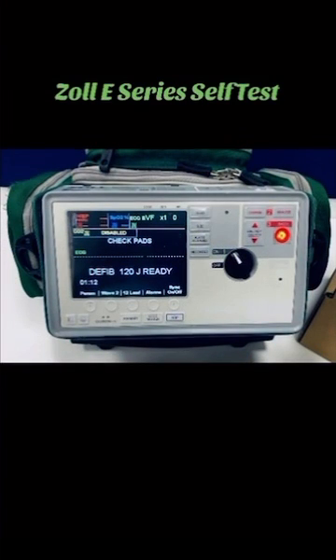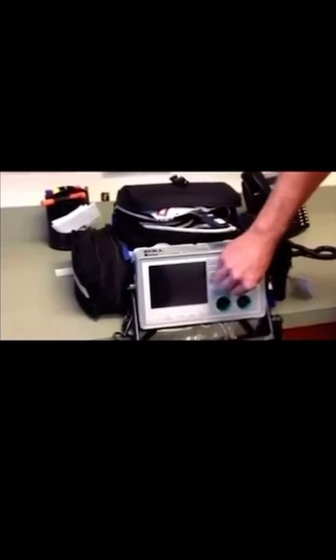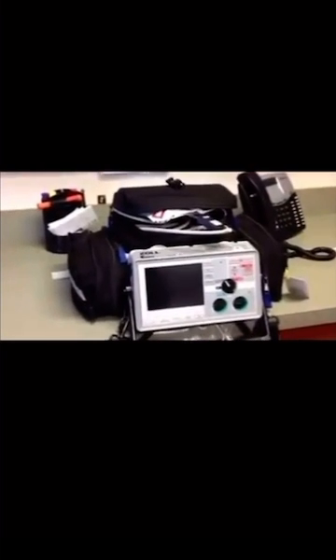Zoll E Series self-test. Step one: turn on your monitor. You should hear four beeps.